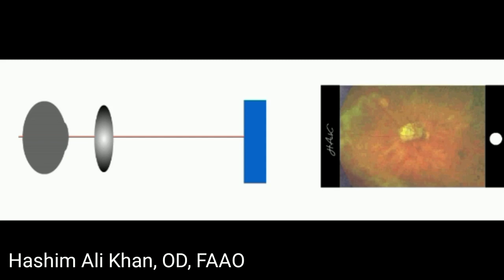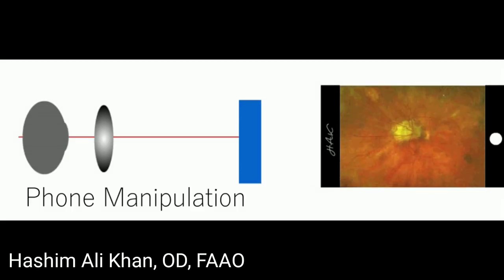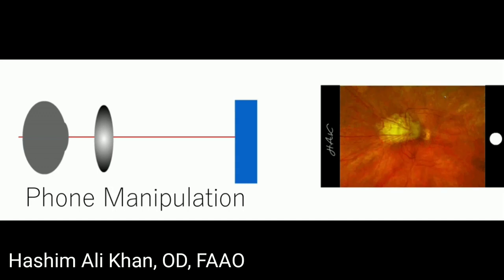Gently draw the lens away from the eye until the fundus glow fills the entire lens. At this point, you can move phone towards the lens to zoom in or away from it to zoom out. You can now start shooting and capturing the images or movies.